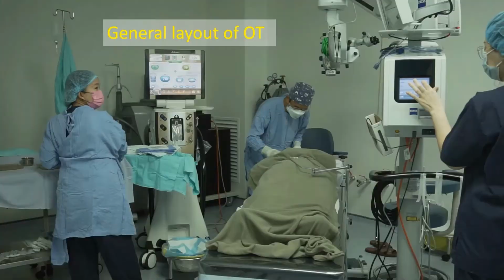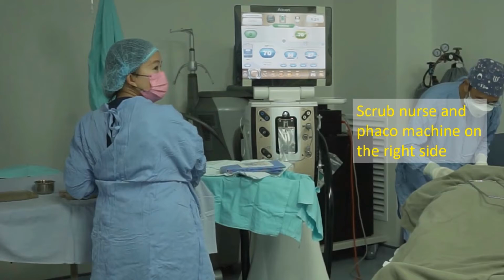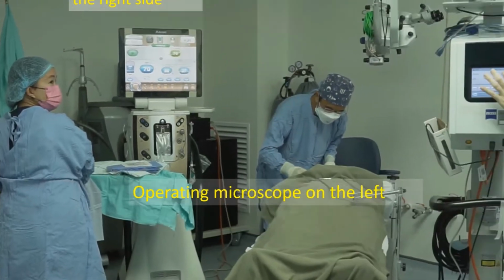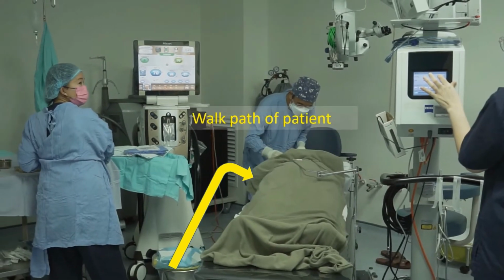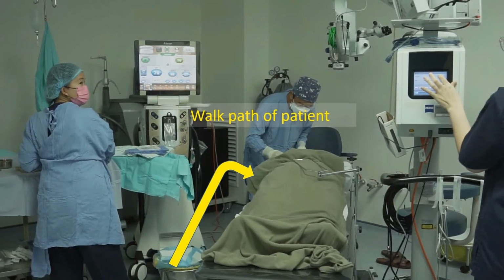This is the general layout of the OT. The trolley and the phaco machine are on the right side of the operating table. The microscope is fixed on the left side of the table. Patients have the same walk up to the operating theatre.